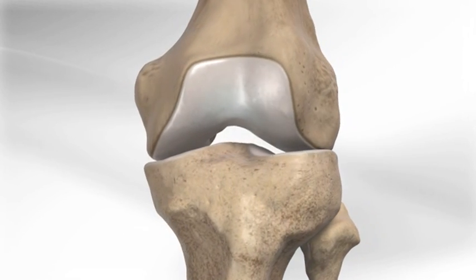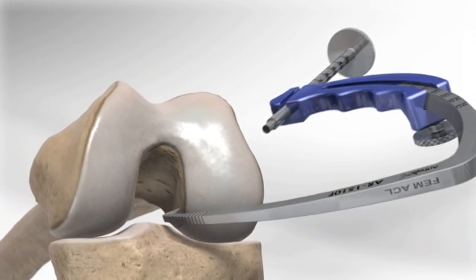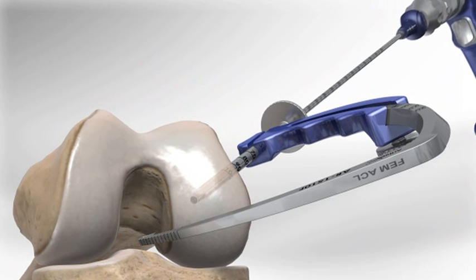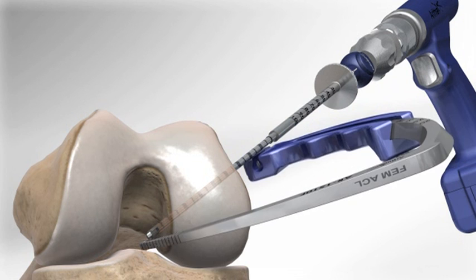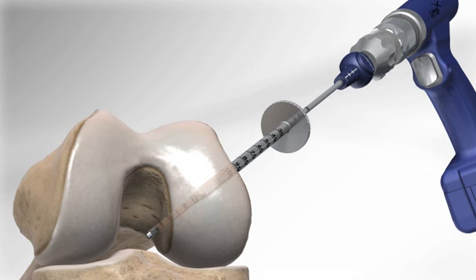The surgeon begins by flexing the knee and placing a drill guide through a small incision in the front of the knee. The guide is placed in the center of the area where the original ACL attached to the thigh bone or femur. A special pin called a flip cutter is drilled through the bone and into the joint. Part of the drill guide is tapped into the bone with a mallet to facilitate drilling.